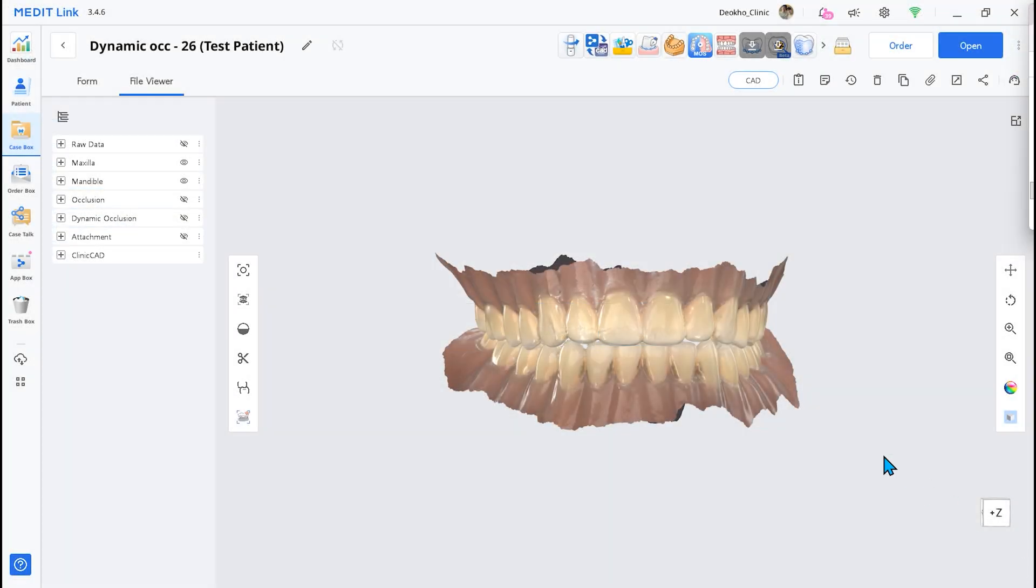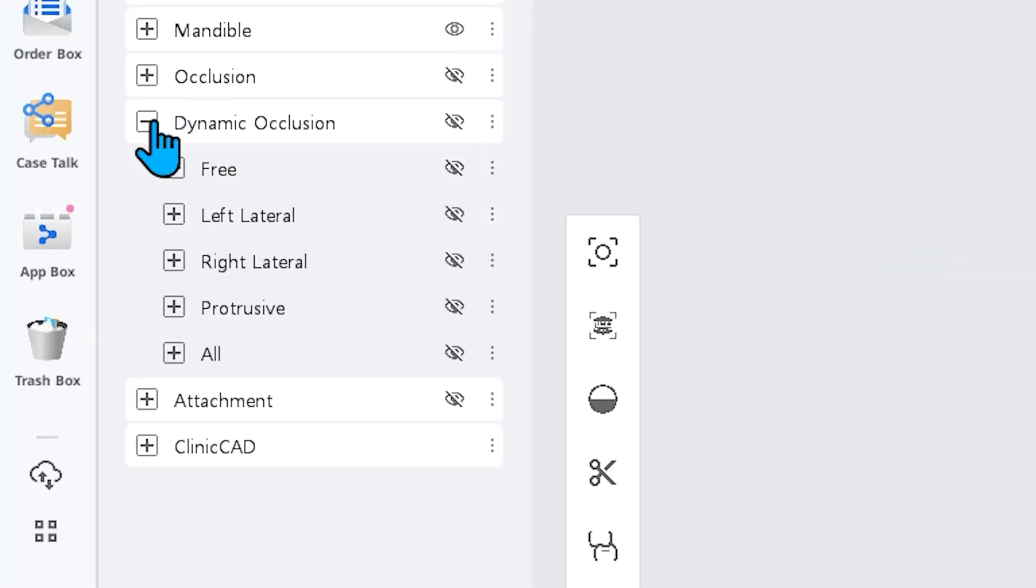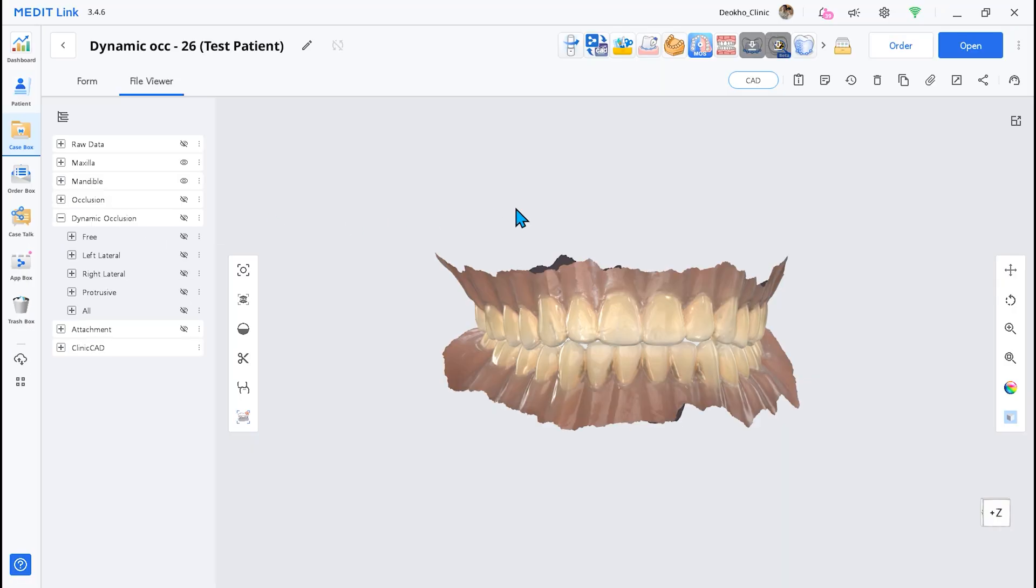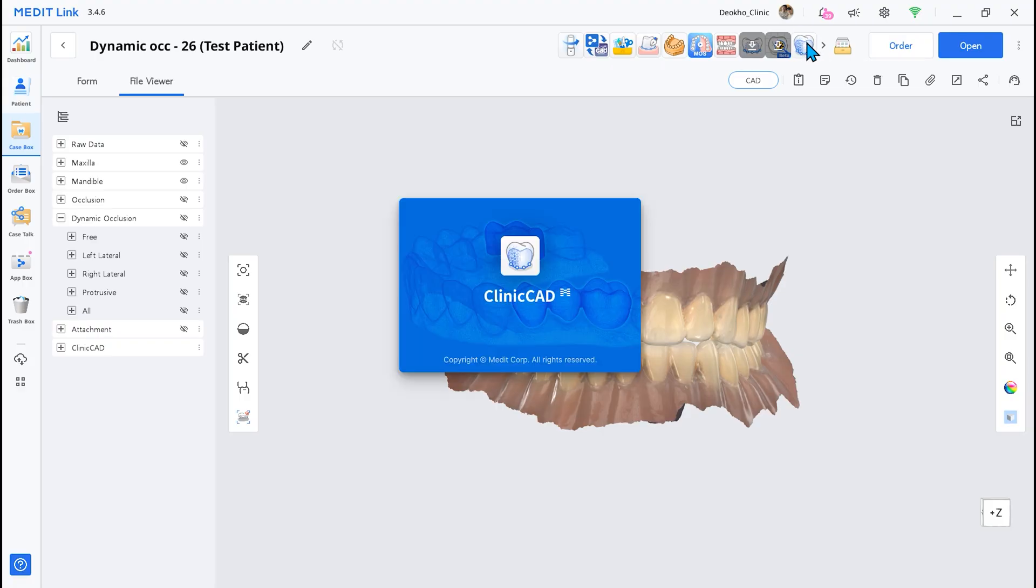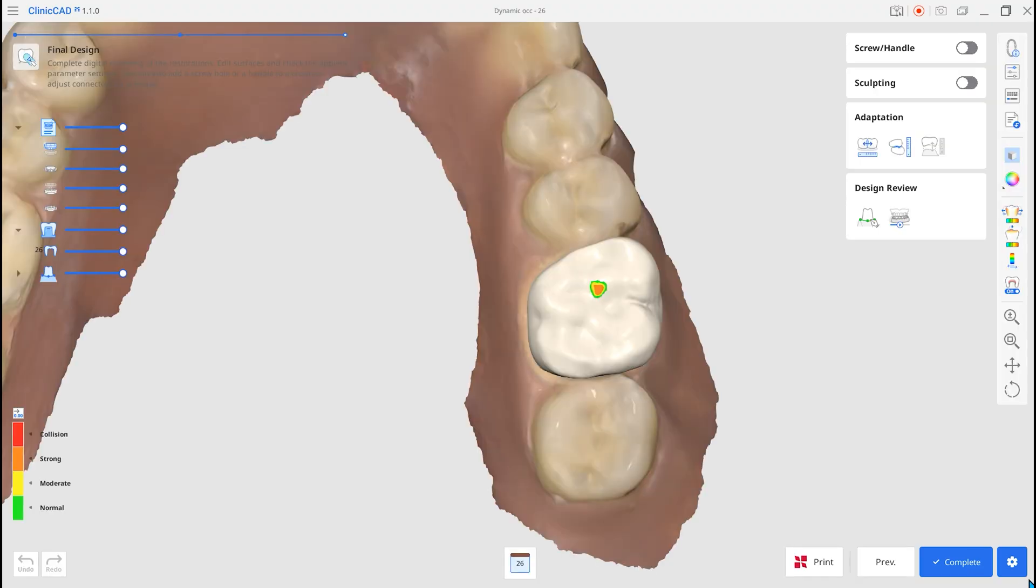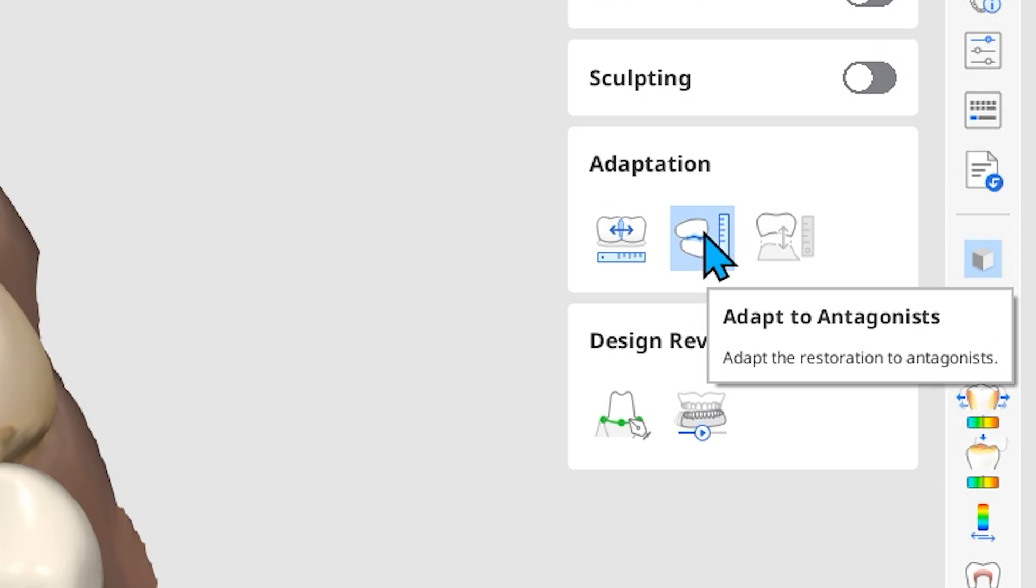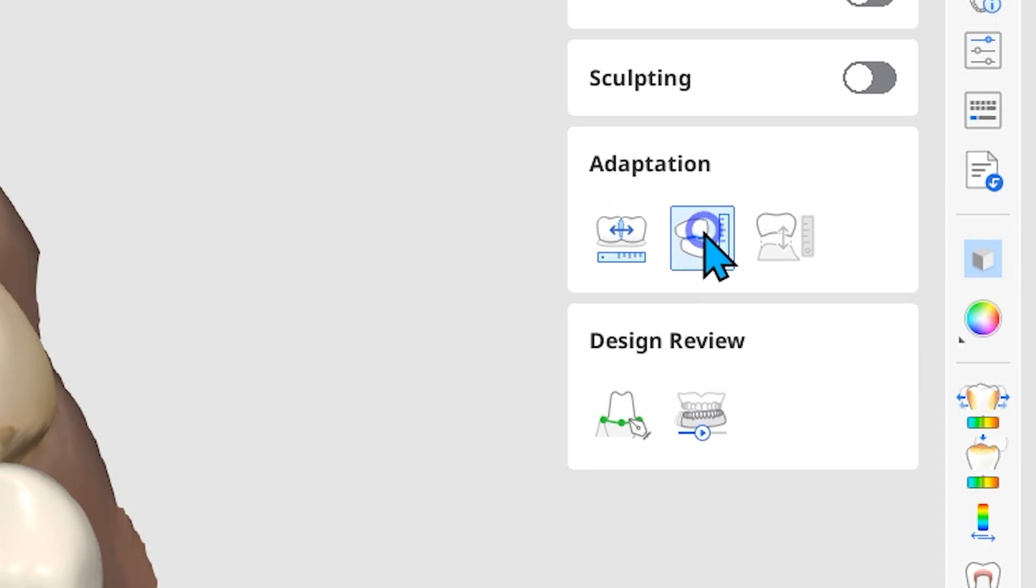Sixth, the Dynamic Occlusion is added. First, check if Dynamic Occlusion Data is available. Then go to Adaptation and select Adapt to Antagonists.